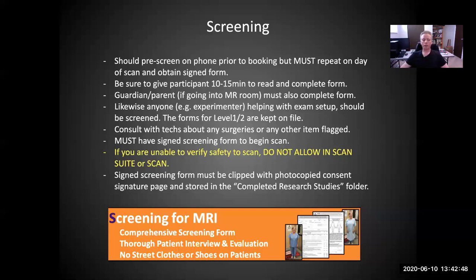And if you're unable to verify the safety to scan, please do not allow this person in the scan suite, and definitely do not allow them to be scanned. In other words, if your bottom line is that you're uncertain whether or not they've passed the screening form and can safely be scanned, then you would always have to turn them away. It is not sufficient to say you're 80% confident.